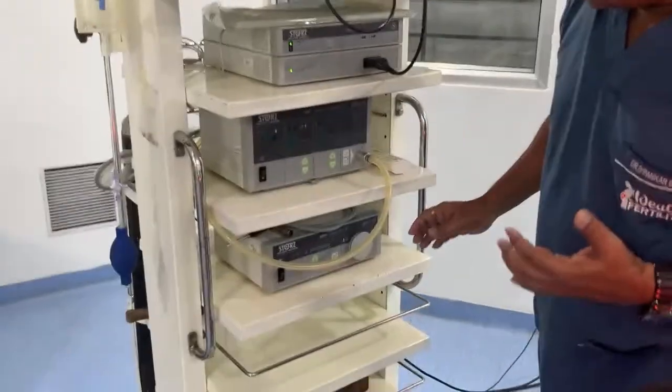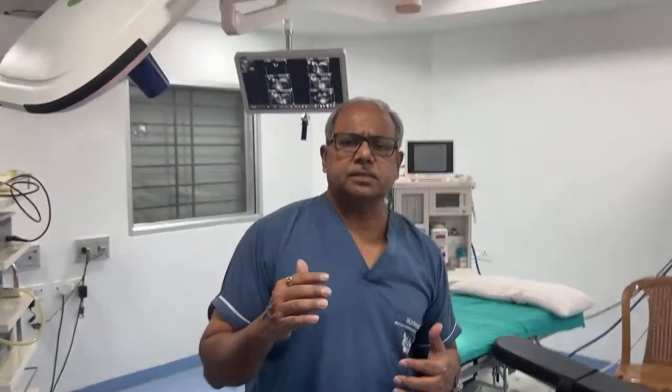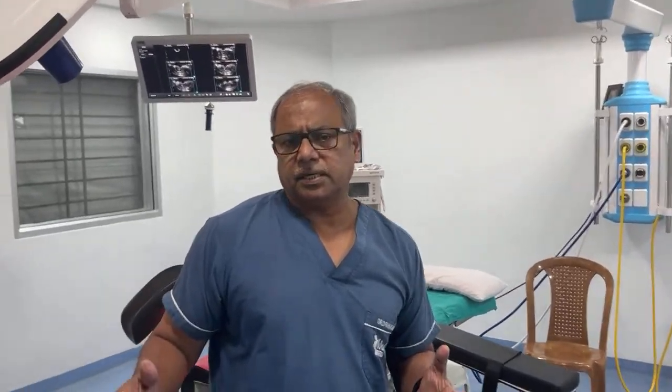Insufflator, this is the light source, and we have the rest with us. Although we are not doing very advanced endoscopy procedures at present, lots of endoscopy procedures are being done here, and we can transmit and record all these procedures.